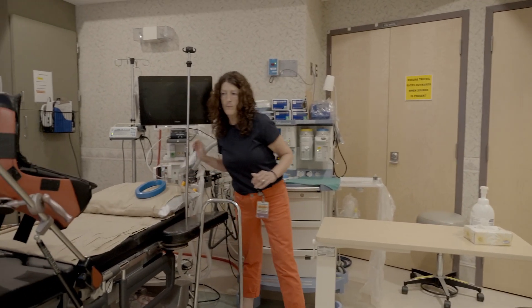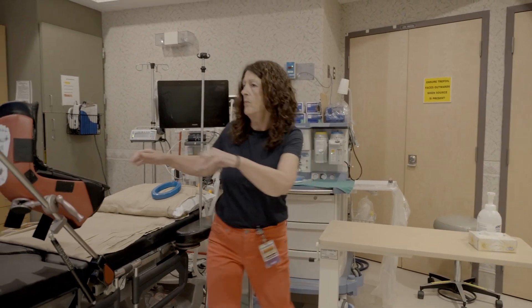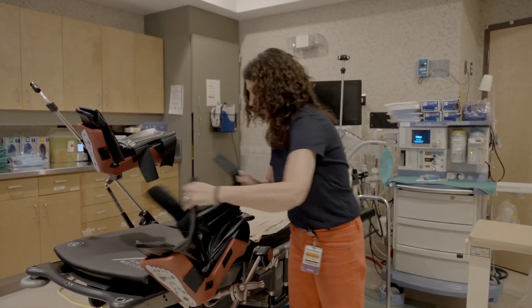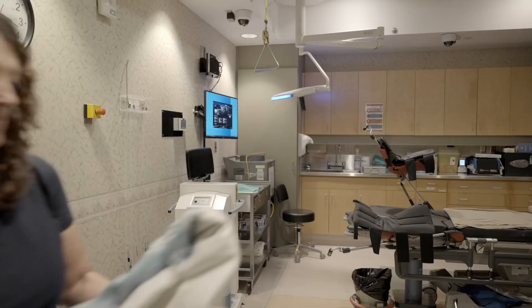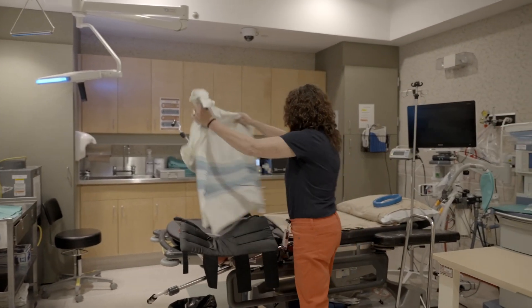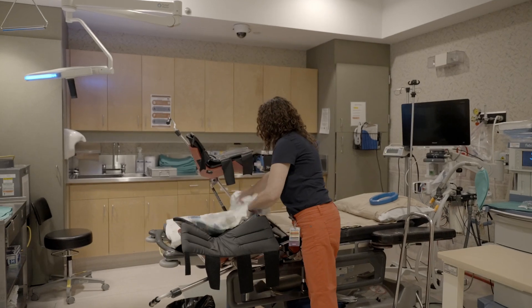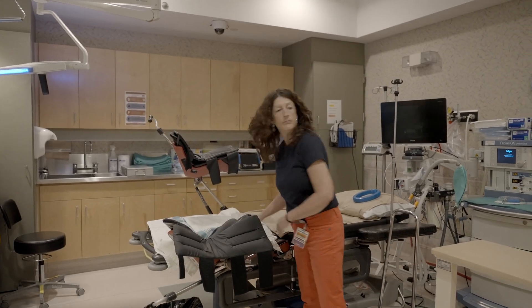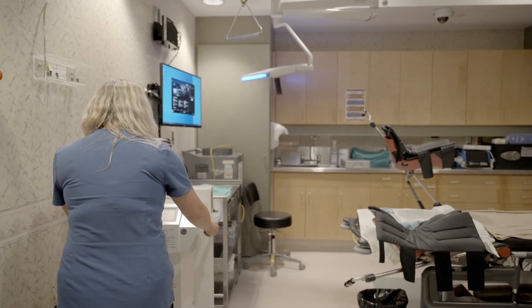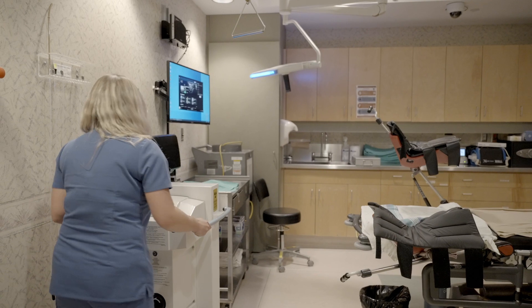High dose rate brachytherapy treatments use a radiation source that is placed close to the disease. These treatments deliver the radiation through an applicator that is inserted into the tumor area. Patients may receive brachytherapy on its own or combined with external beam radiation or other types of cancer treatments such as chemotherapy.